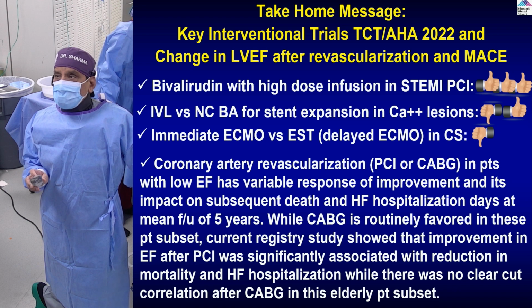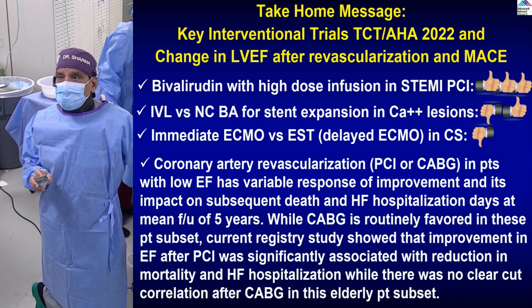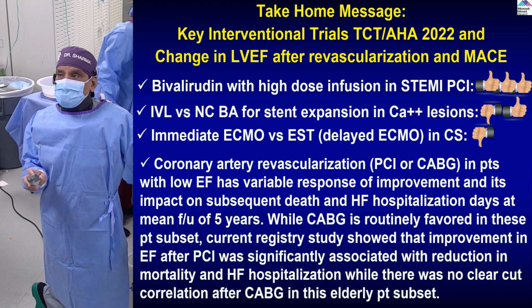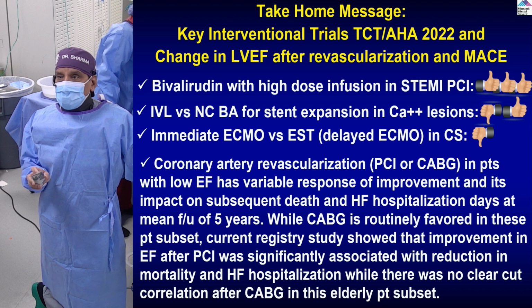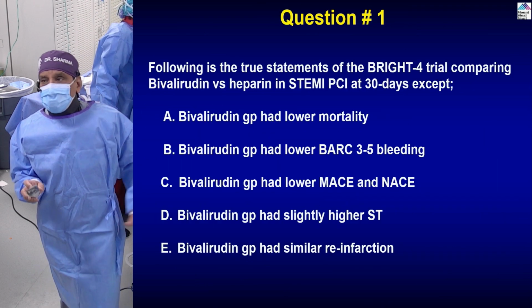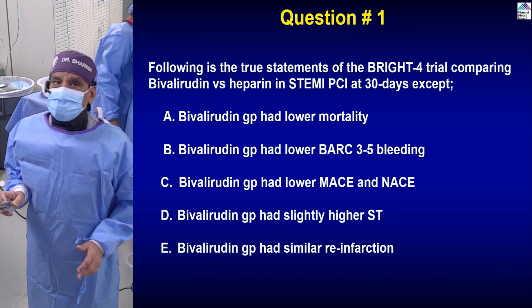While CABG is routinely favored in this patient subset, a current registry study showed that improvement in EF after PCI was significantly associated with reduction in mortality and heart failure hospitalization, while there was no clear-cut correlation after CABG in this elderly patient subset. So quickly, 3 questions.